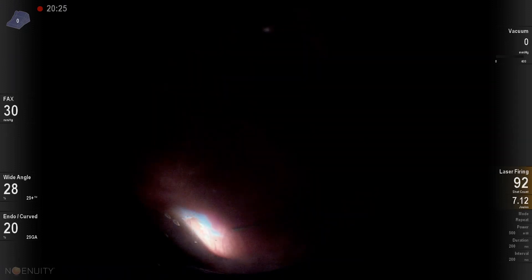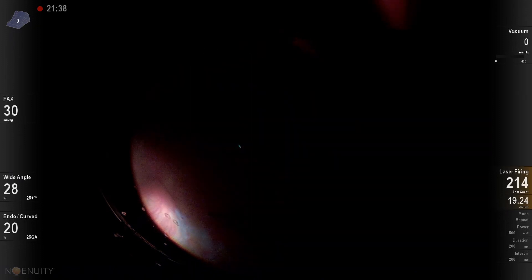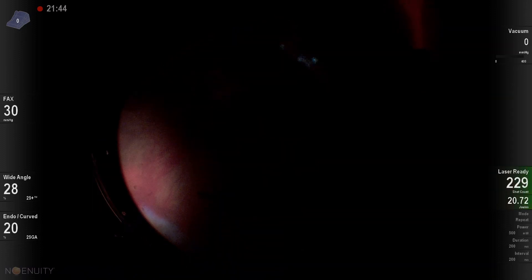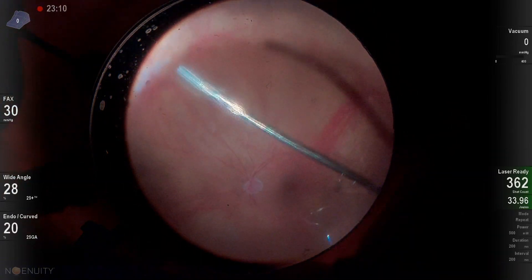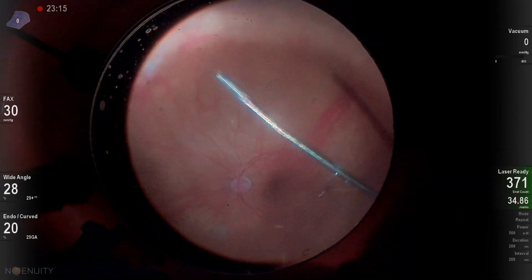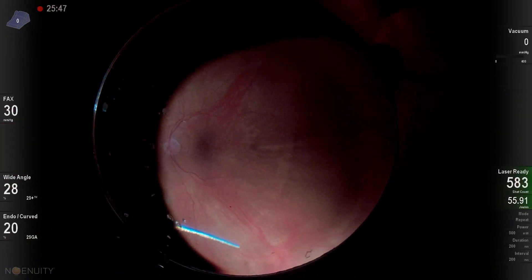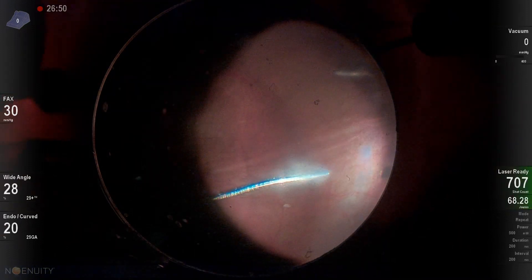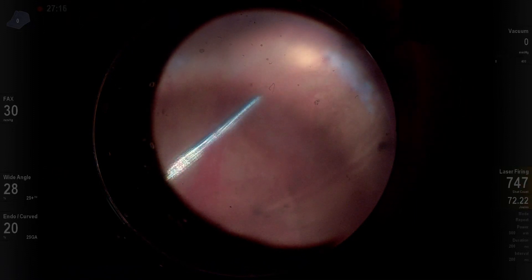My light changed here because I'm depressing and utilizing the Alcon 25-gauge illuminated directional laser probe — I really like this laser probe. In this patient, I'm going to laser 360 degrees. I don't always laser 360 during a primary vitrectomy for retinal detachment repair, but this patient had multiple breaks superiorly. I laser 360 sparing the posterior ciliary nerves, targeting where the vitreous inserts, with a couple of laser spots posterior and one or two anterior to that vitreous insertion, going around 360 degrees.